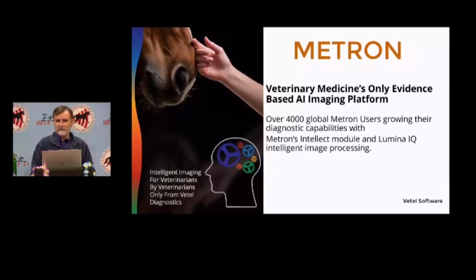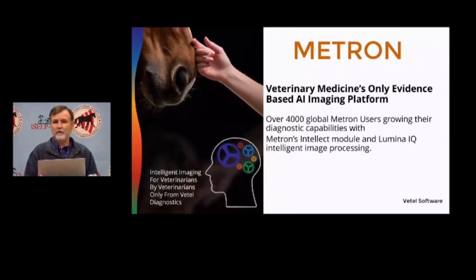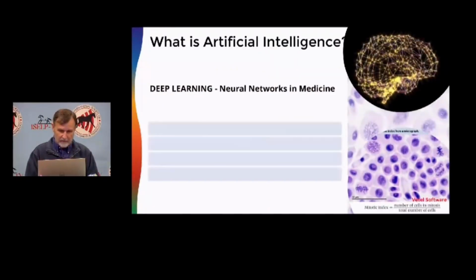Artificial intelligence is going to be the fabric of our lives forever, and it's important that you understand a little bit about what the characteristics are of an artificial intelligence platform so you can make good decisions when it comes to medical imaging devices and artificial intelligence.